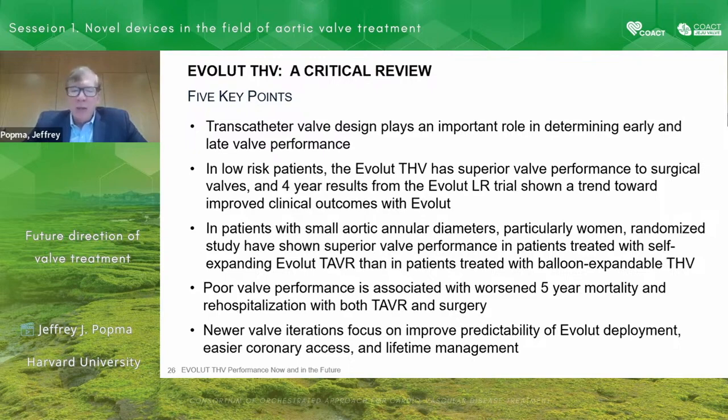We know from our prior series that poor valve performance is associated with worsened 5-year mortality and rehospitalization, with both TAVR and surgery. And we will continue to iterate and come up with new valve iterations that will focus on predictability, easy access, and lifetime management.